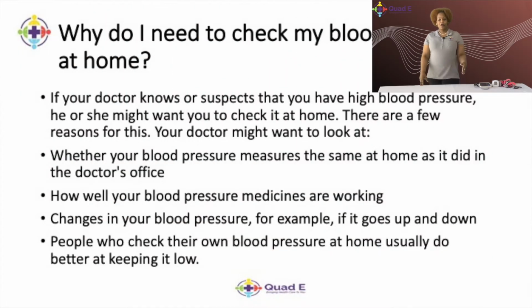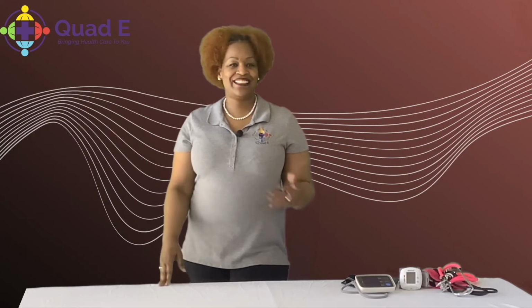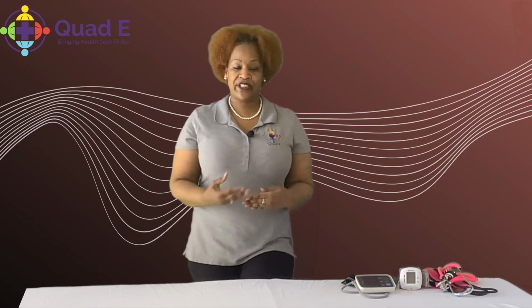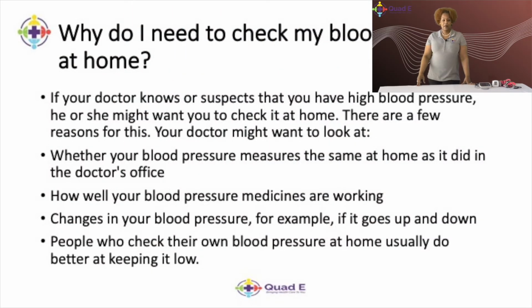We want to see whether your blood pressure measures the same at home as it did in your doctor's office, okay? We also want to measure how well your medications are working. There's a plethora of medications out there that the doctor can put you on depending on your age, your race, your heredity, your cholesterol, lab work. So you want to make sure that the medications the doctor ordered for you are working correctly, and watch for changes in your blood pressure, for example, if it goes up or if it goes down. And people who check their blood pressure at home usually do better at keeping it low.